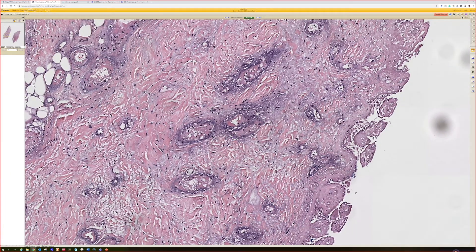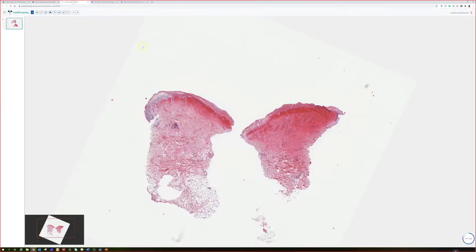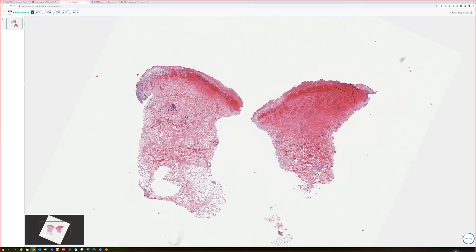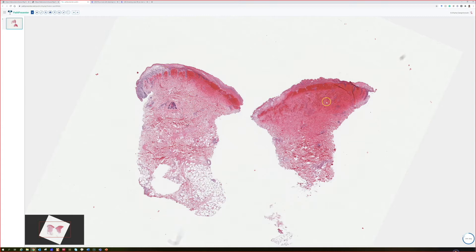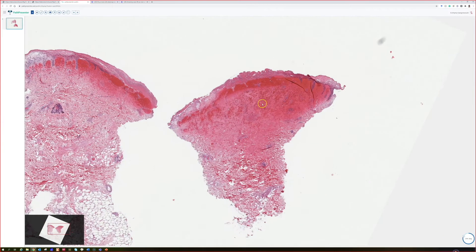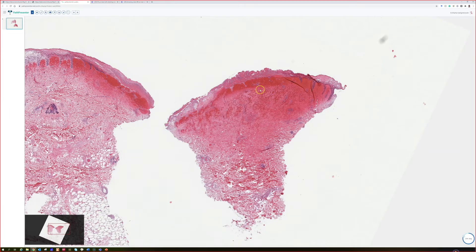Let me show you one other case that's really nice from Path Presenter — this is courtesy of Dr. Raj Singh, I believe he's the one who submitted this case. Again, dead and dying tissue, the epidermis is sloughing away, tons of hemorrhage in this case.